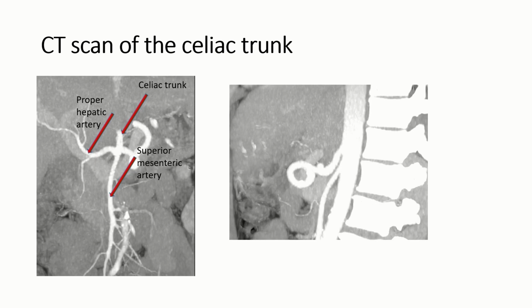We will now selectively engage the celiac trunk. As you can see, it's a very steep angle for femoral access, and you see that we chose the radial access in this case.